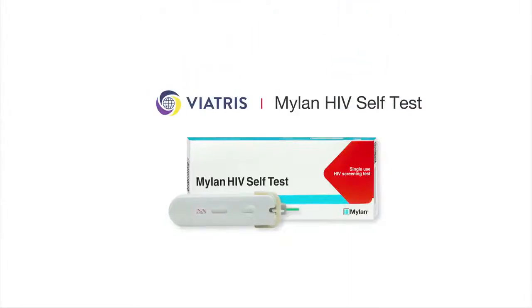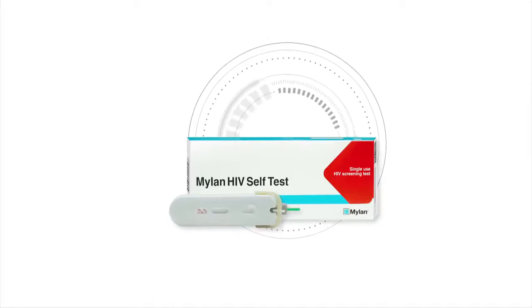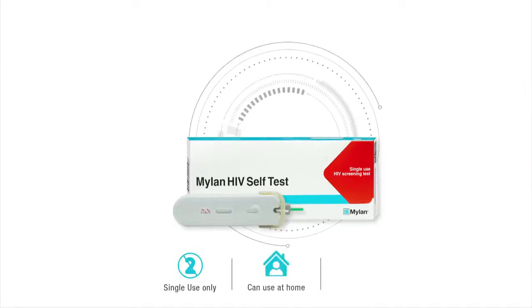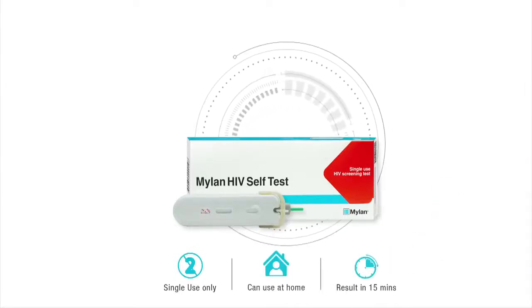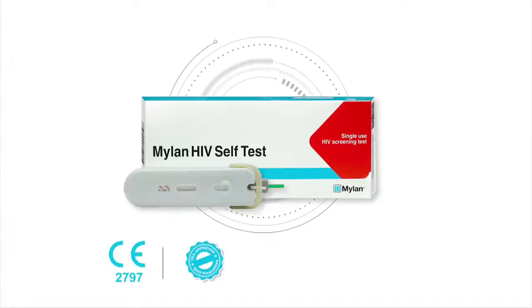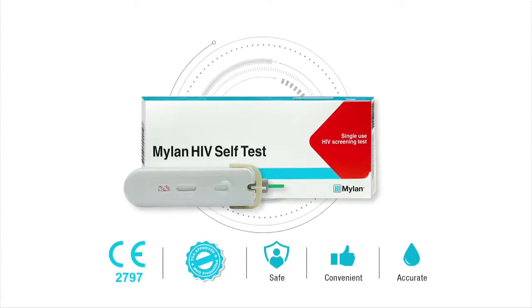Thank you for purchasing Mylan HIV self-test. This video will take you step-by-step on how to use your Mylan HIV self-test. Mylan HIV self-test is the world's only integrated single-use self-test device designed as an at-home screening test with results obtained only in 15 minutes. It is CE-certified, pre-qualified by WHO, approved by TGA, and is a safe, convenient and accurate way of screening yourself for HIV with just one drop of blood.